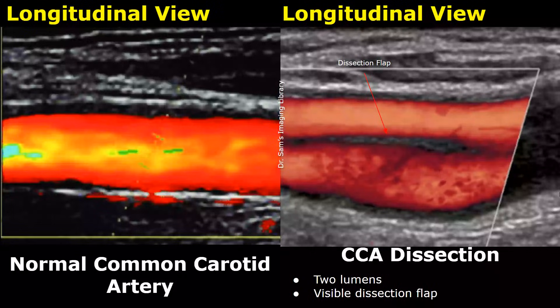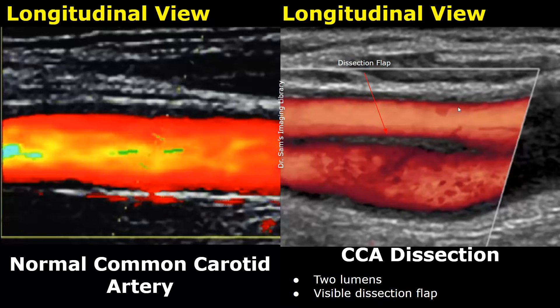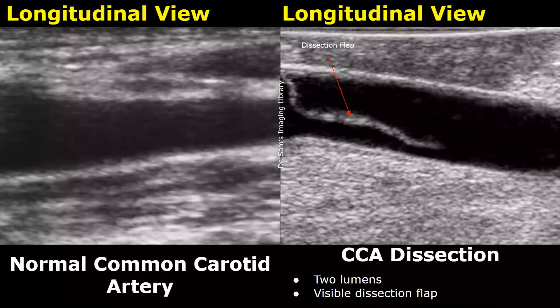This image shows normal blood flow in a common carotid artery using color Doppler. This is a case of common carotid artery dissection — there is a tear in the intima layer of the common carotid artery. On ultrasound, two lumens may be seen in some cases with a visible dissection flap. This is the dissection flap, giving the appearance of two lumens. Here is an image without color Doppler applied, and we can see a dissection flap floating within the lumen of the common carotid artery.